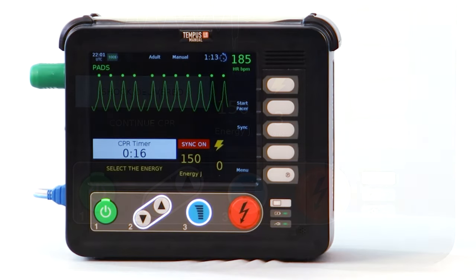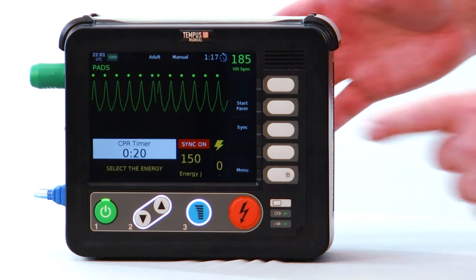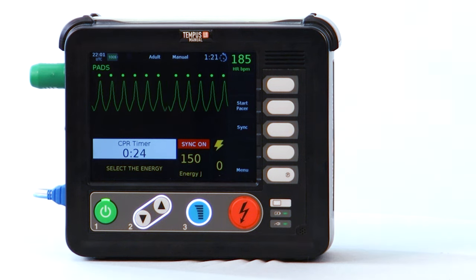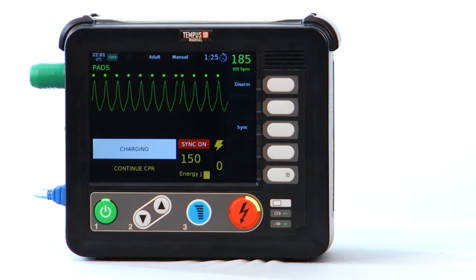Pacing and cardioversion are easily initiated through selecting the membrane button next to the therapy mode desired. Once in the desired mode, the user selects the desired treatment parameters based on protocol guidelines and therapy can be delivered.